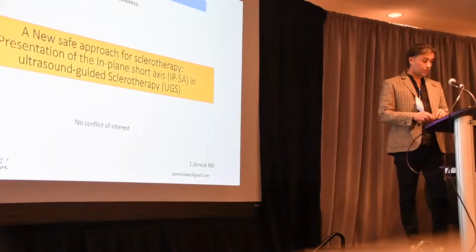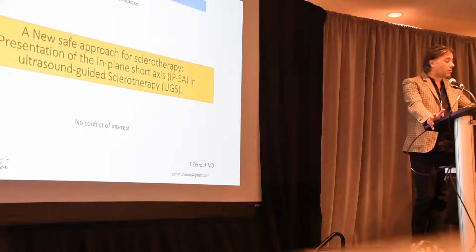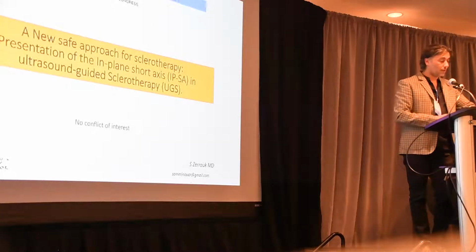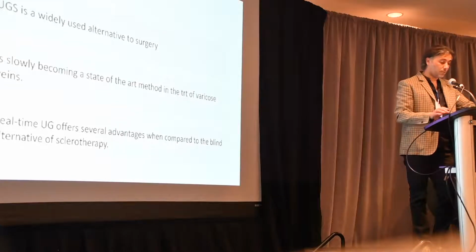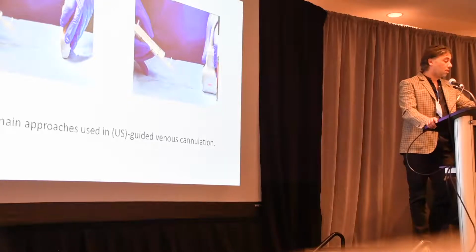In this presentation, I will talk about a new safe approach to sclerotherapy and the evaluation of the two classical approaches in ultrasound-guided sclerotherapy. Ultrasound-guided sclerotherapy is a widely used alternative to surgery. It is slowly becoming the state-of-the-art method for the treatment of varicose veins, and real-time ultrasound guidance offers several advantages when compared to the blind alternative.